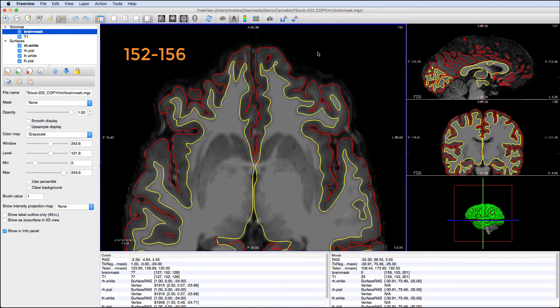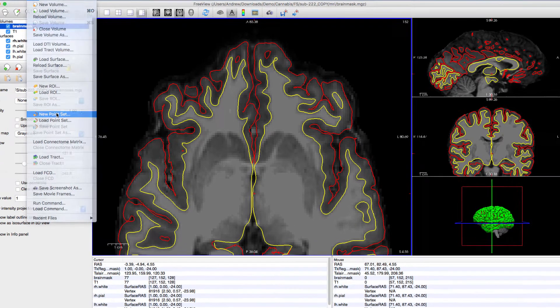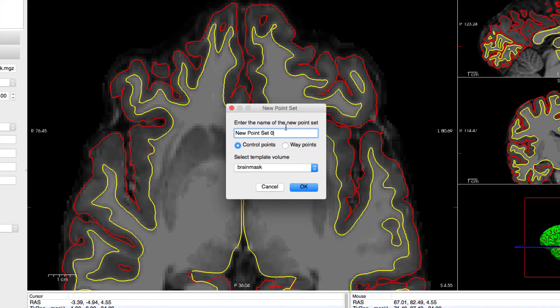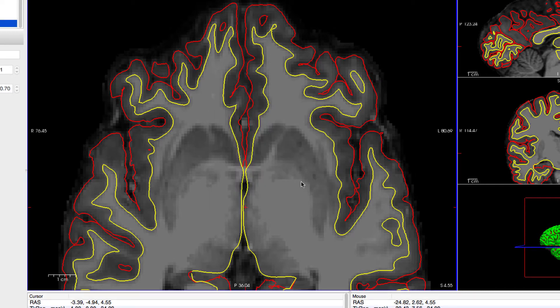To add control points, click on File, New Point Set. Call it Control.dat and make sure the brain mask image is selected as the template.